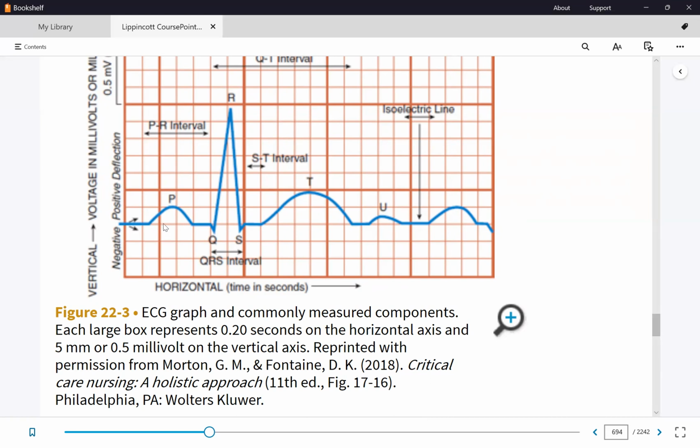But it's not 0.12 because I have a half box here. So I have 0.02. So 0.02 plus 0.12 equals 0.14, correct? Okay, so count the entire box. Well, this one's only half a box, because this is time. We don't round.